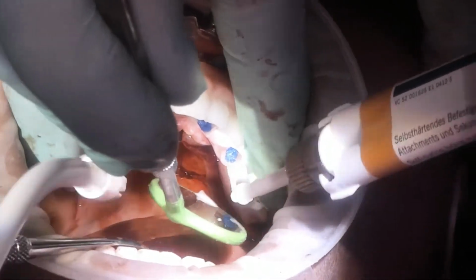And each site is backfilled until the prosthetic is connected to the temporary cylinder. And that is the pickup process.